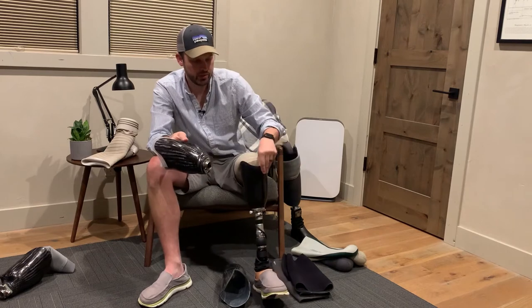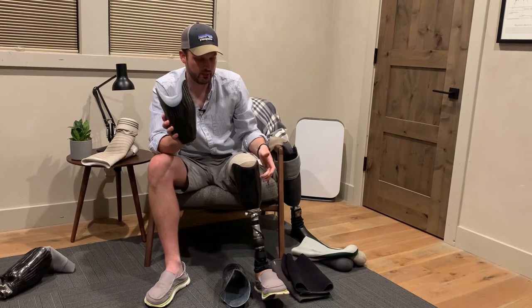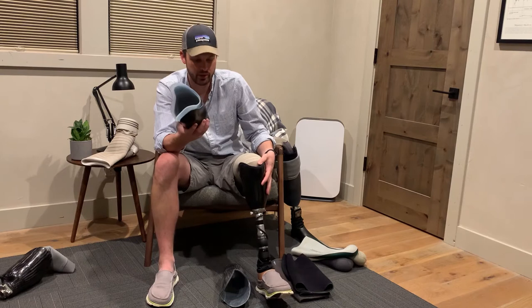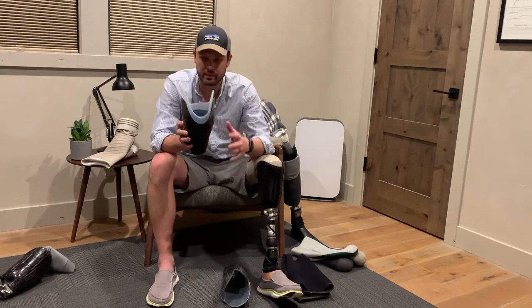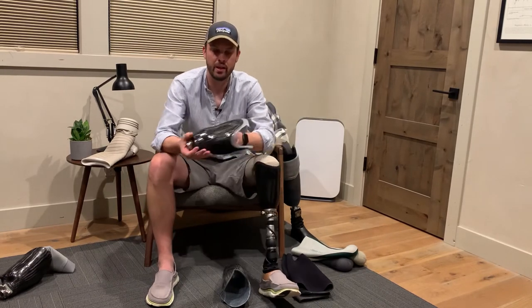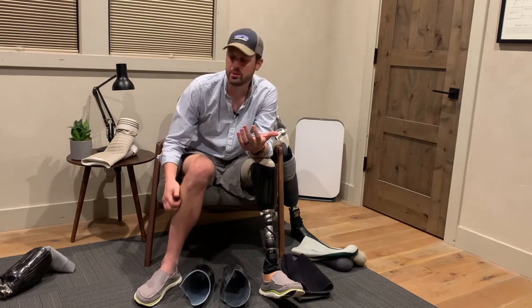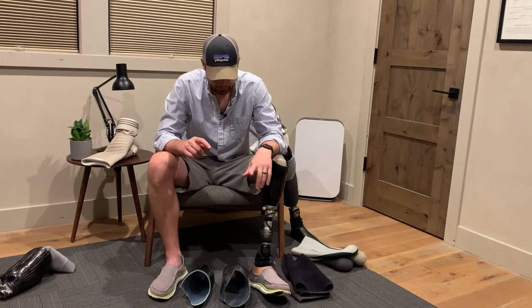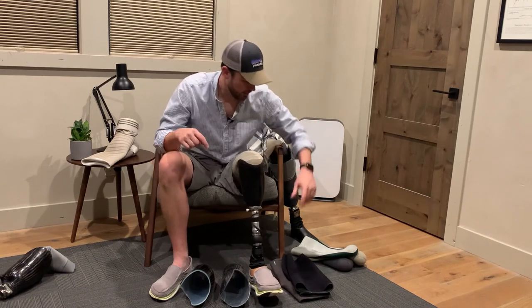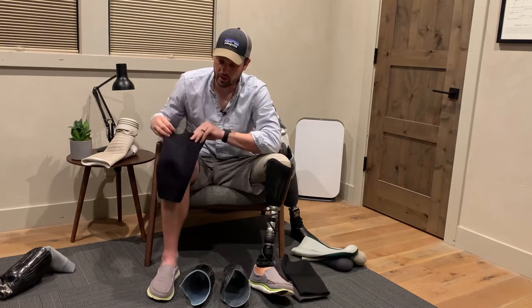That said, an inner socket isn't totally necessary. My new socket doesn't have one, and if you look at how thick it is, it reduces the width a lot — much less bulk. The measurements I took comparing one of my more recent sockets to my new one with the liner showed it's almost half an inch thinner from side to side, which when you're putting on pants makes a huge difference.